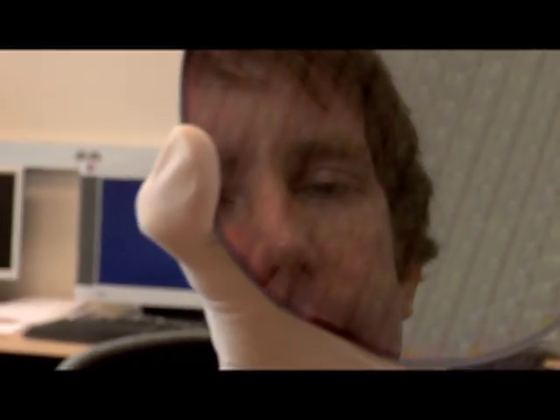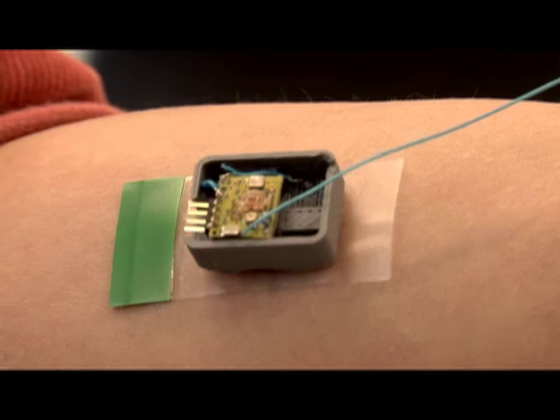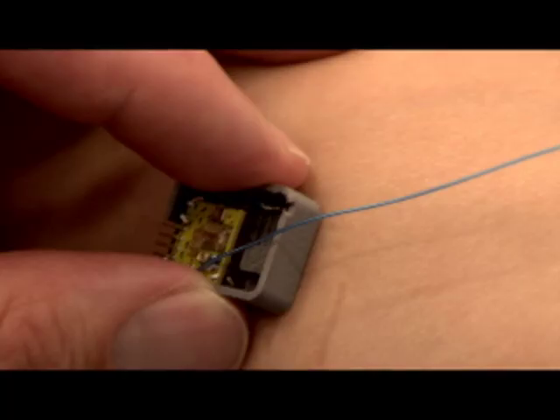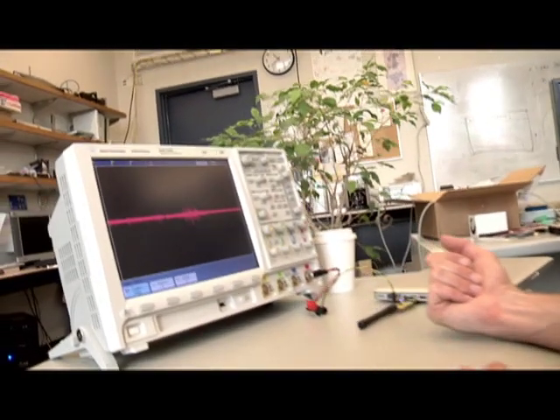The concept for the Bumblebee really came out of collaborations we've had with other people on campus who had the need to do recording from the brain and from the body, and there simply were not tools available to do this kind of research. Brian Otis, Chet Moritz, and I have put together a new therapy technique — taking an older technique and applying new technology to bring it to the therapeutic world for individuals with movement disorders such as stroke, traumatic brain injury, and cerebral palsy.